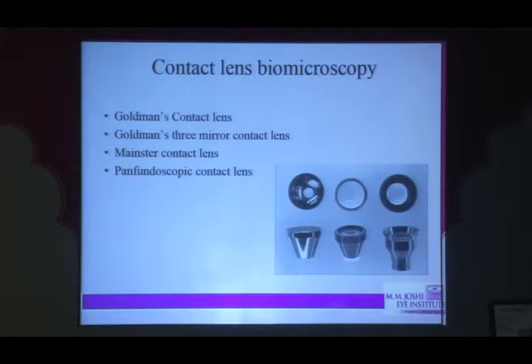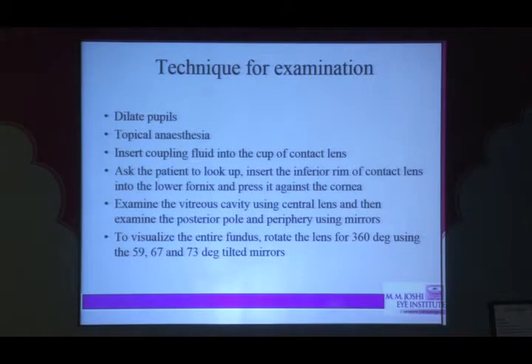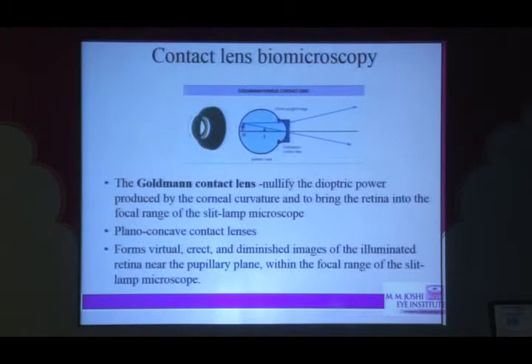Just a brief touch about the contact lens. We use it mainly nowadays in the laser. Nobody much uses it on an OPD basis, but of course the contact lens viewing is much better as compared to the non-contact lenses. But yes, it has its own advantages and disadvantages. You need a coupling fluid in the cup of the contact lens, and the patient is asked to look up. And if you're using the 3-mirror, then you have to rotate the lens 360 degrees, looking at the different parameters.